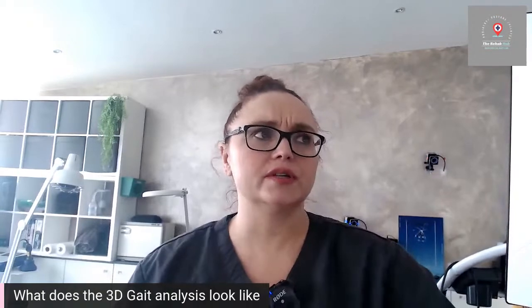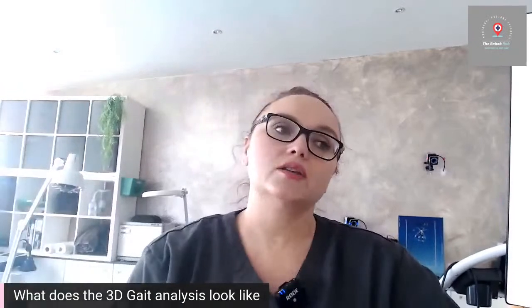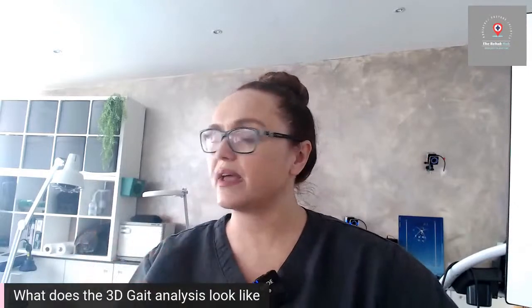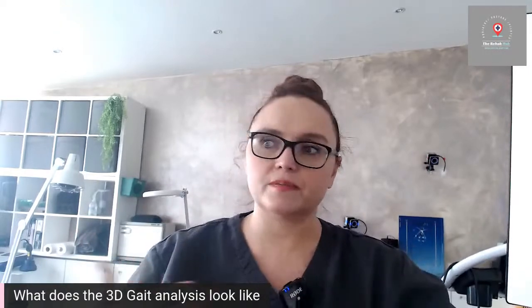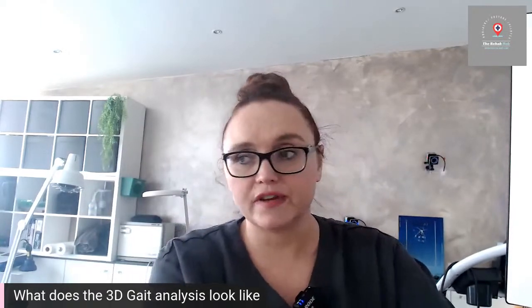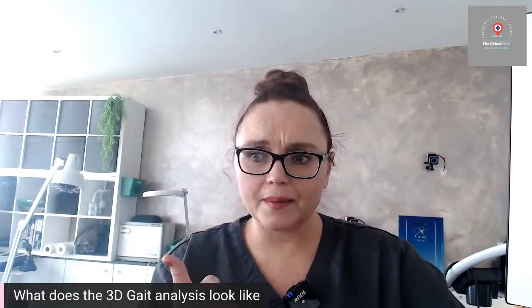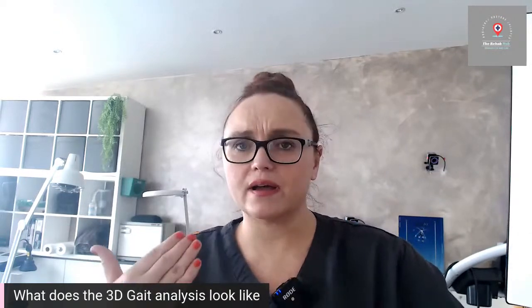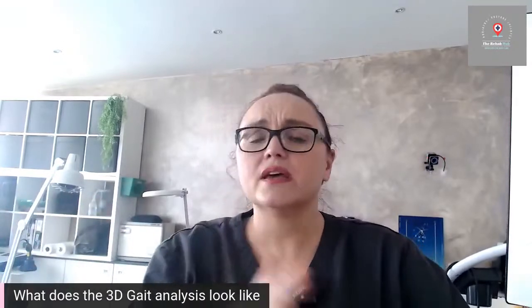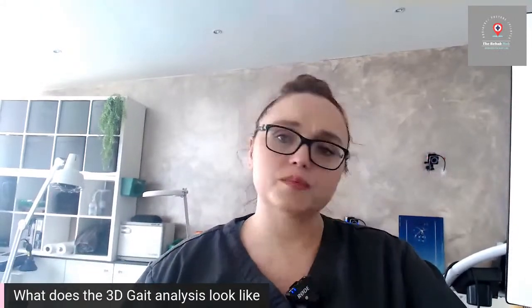So we do that, that's absolutely normal. Or we can do it in-house. So say you've got a particular injury and you want us to coach you all the way through that, we can absolutely do that too. So whether you're working with a physio or whether you are a physio or a healthcare provider, we are more than happy to work on a referral basis where you can refer your patients in, and we would absolutely refer them back over to you with that full report of findings, with your patient's permission. So you've got that data, you've got that absolute thorough assessment there. It's kind of like sending your patient for a movement MRI so that you can see exactly what's going on, so you can then best help them. So that's something we do quite a lot as well.